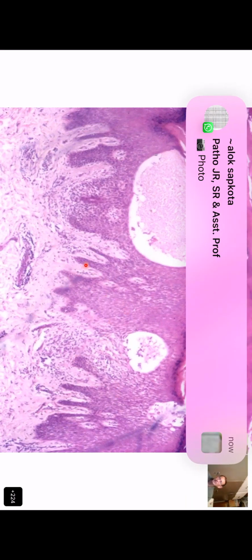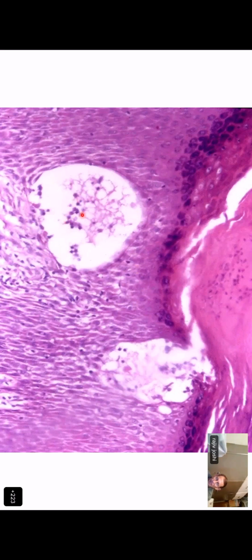What you see are mainly a few lymphocytes in the primary pattern. So here, if you see, there are two patterns: an intraepidermal vesicular and a spongiotic. So you can follow it either way. You can take it as an intraepidermal vesicular dermatitis with spongiosis, without eosinophils, without neutrophils, and there are no acantholytic cells here really. Most of these are lymphocytes. So this is entirely within the epidermis. This is spongiosis, and these are small areas of parakeratosis. So this is a spongiotic dermatitis. So the best diagnosis here would be spongiotic.